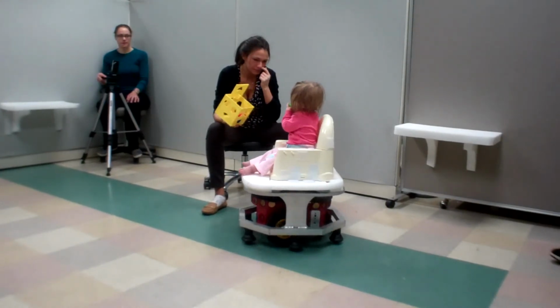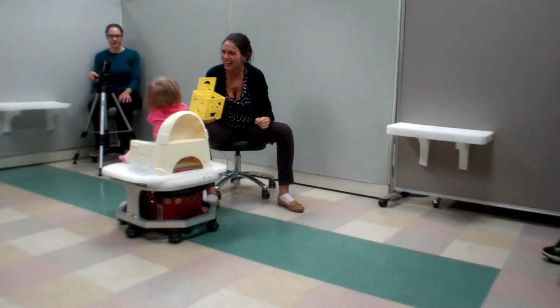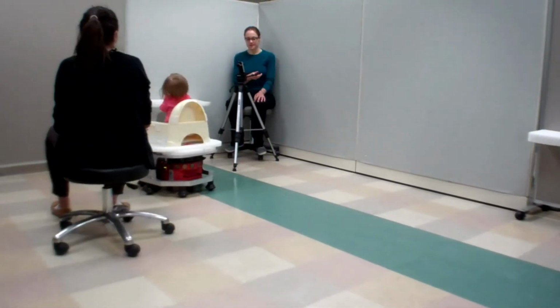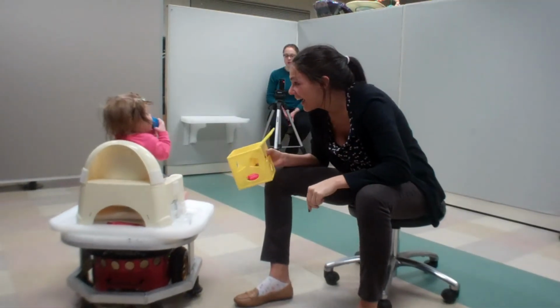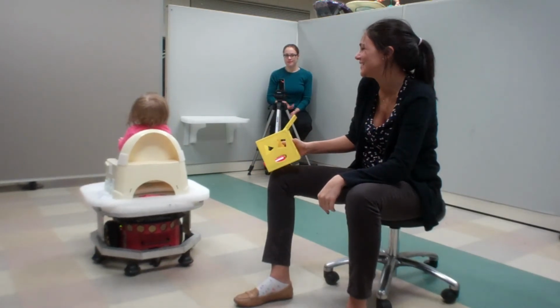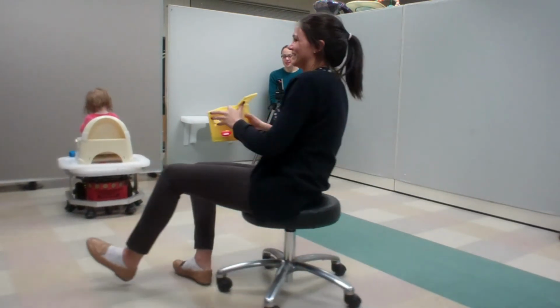We want to see, with babies who do not have independent mobility, who aren't yet able to creep, will, say, 12 visits, 12 experiences of the robot, make a difference in their development that we don't see in babies who don't have the experience. Particularly, we want to look at typically developing babies to see if we provide earlier mobility, will they learn other things more quickly? And of course, we really want to look at babies with disability. Does it make a difference for them?